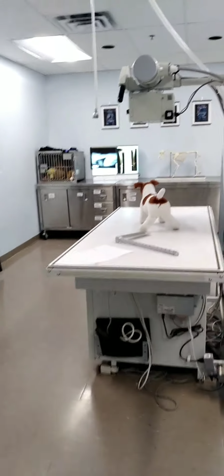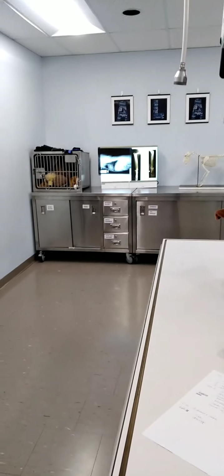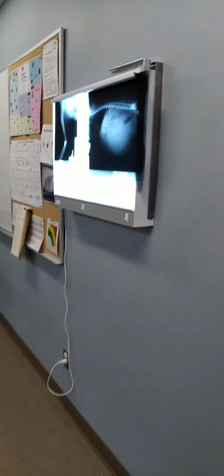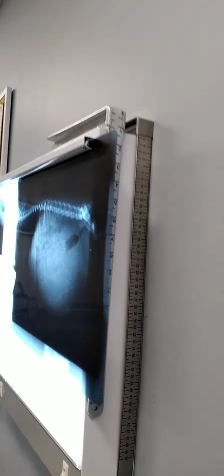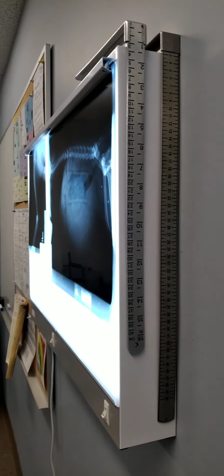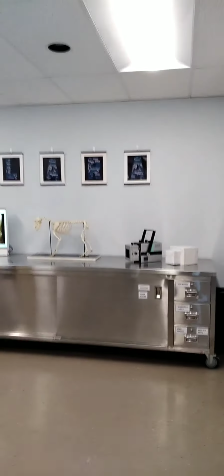One thing I did not show you, so most of the things that are in here are really, really well labeled. We also have calipers. This is one of them. These calipers are used for measuring the patient, and they commonly live up here. I have 2 more hanging up here, as you can see. They're hanging on the side of the view box. Okay.